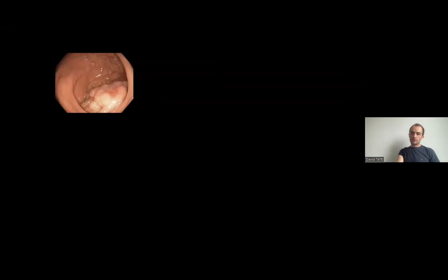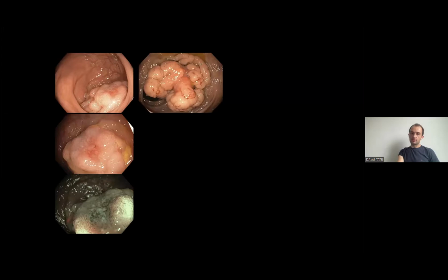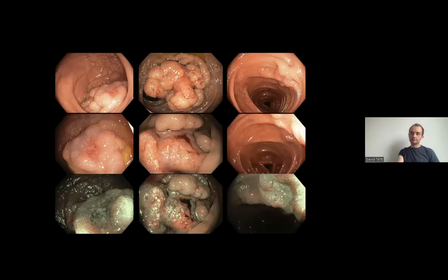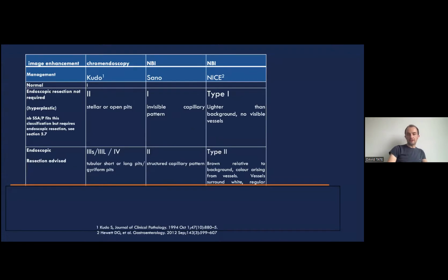So we'll skip that. Let's consider these polyps. Each one is a zooming in of the other. Another one, zoomed in, another one. And all of them contain a demarcated area. Now, a demarcated area is, just as it says, an area that is clearly bounded, that you can draw a line around within each one of these polyps, and it signifies the presence of a problem. It doesn't always mean that that polyp contains cancer, but it's something that should direct your further attention.